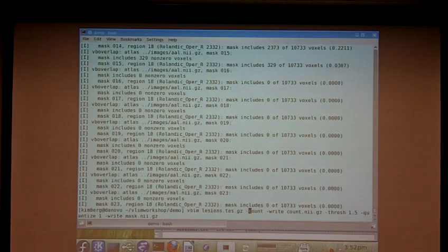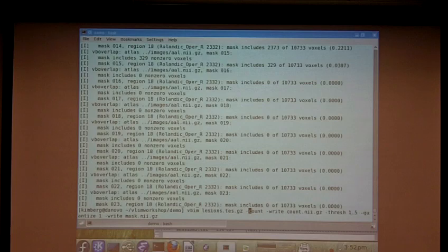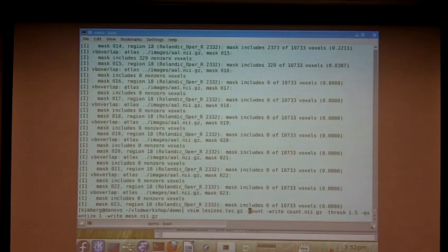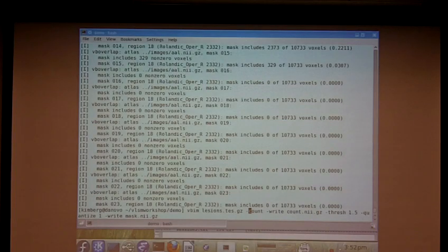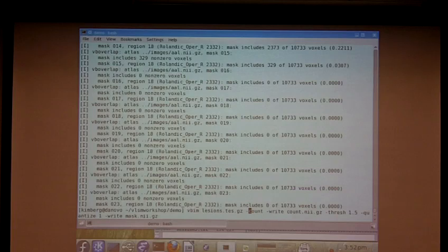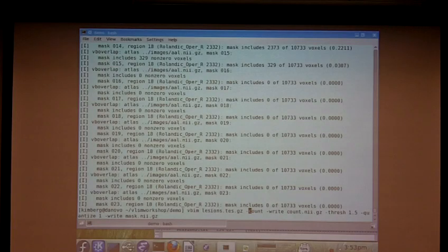So dash count means convert all those lesion maps, all 24 of them, to a single map that just has in it a count of how many non-zero values there are in each voxel. So that actually gives you a count map for the entire volume.